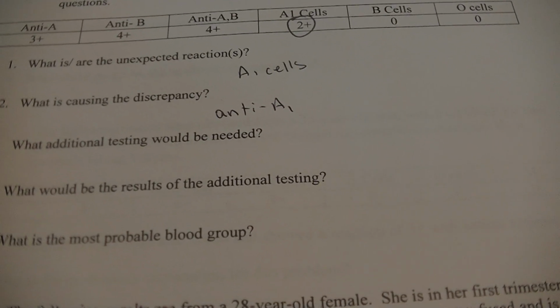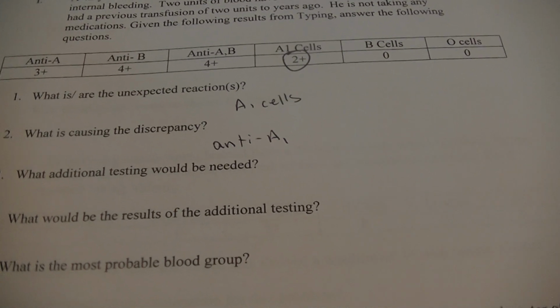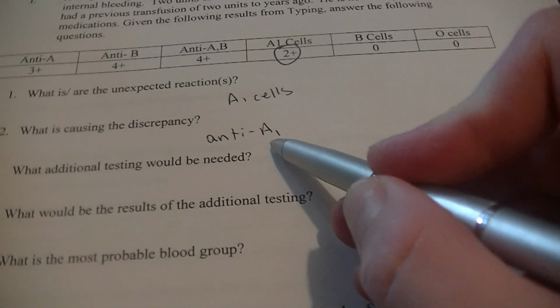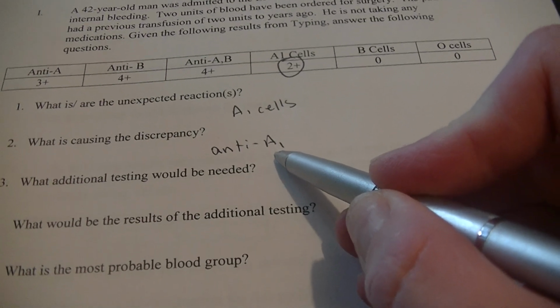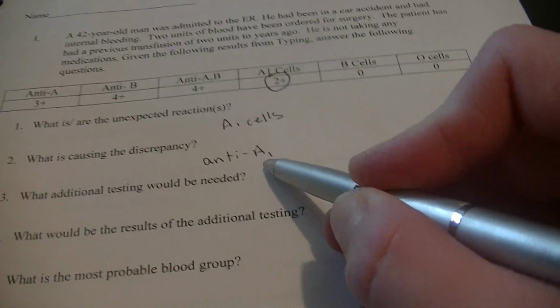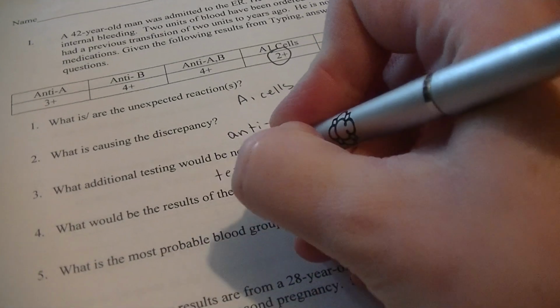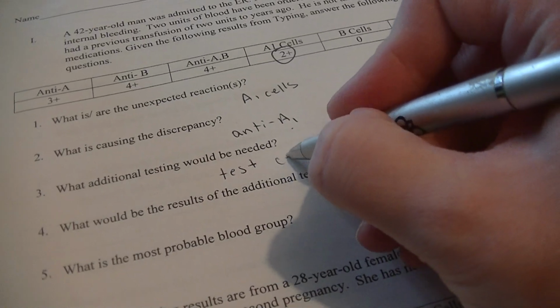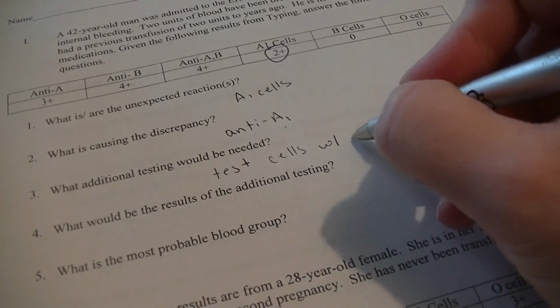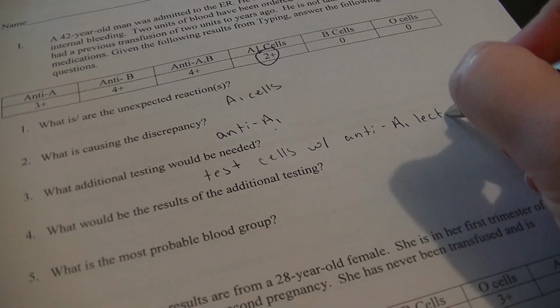What additional testing would be needed? Well, if we have an anti-A1 antibody, this person is probably a subgroup or subtype of A with their A antigens on their blood cells. So what we need to do is test this person's cells with anti-A1 lectin.